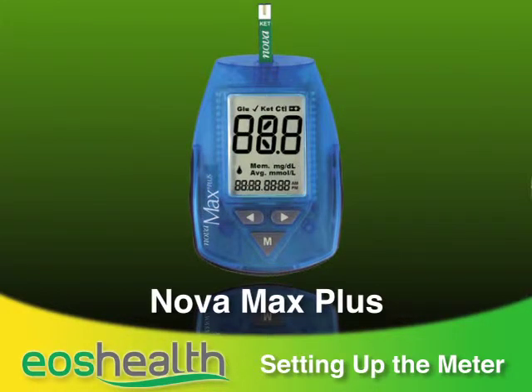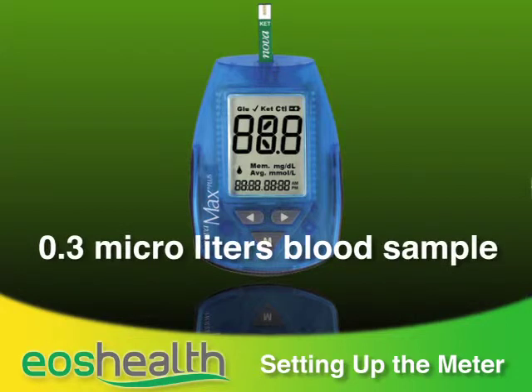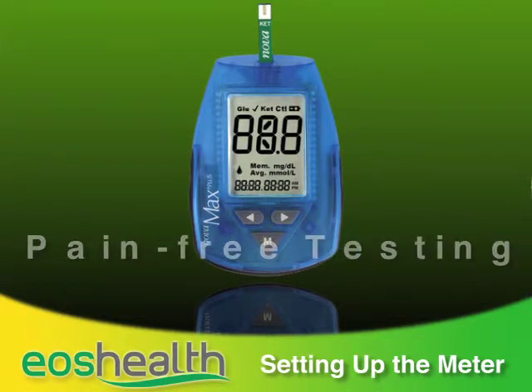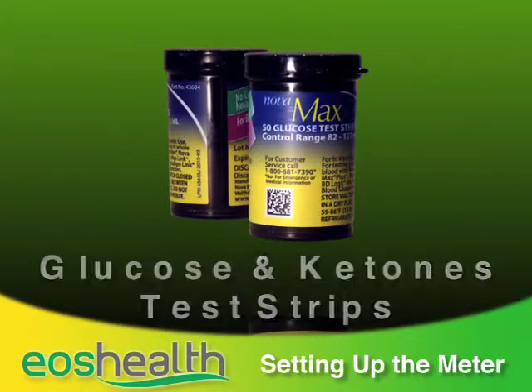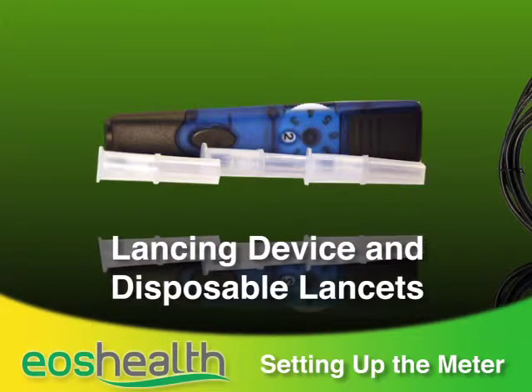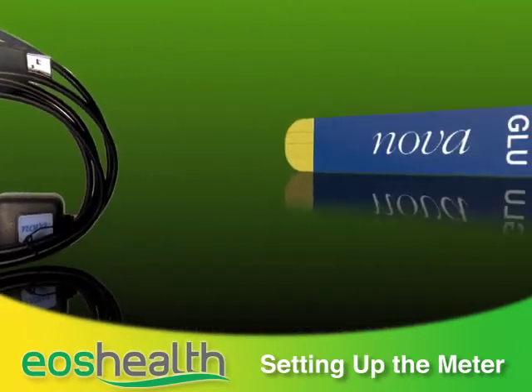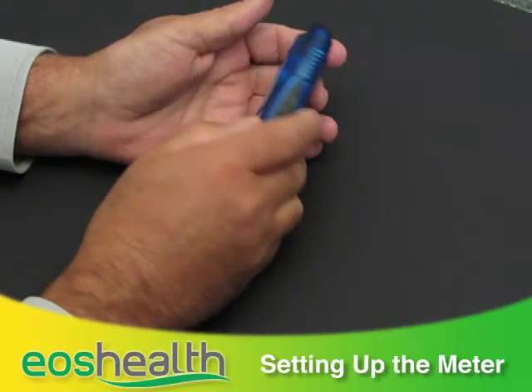We'll be using the Nova Max Plus blood glucose and ketones monitoring system — we'll call it Max for short. Max measures either your blood glucose or ketone levels, and it requires only a tiny blood sample of 0.3 microliters, so the meter can use a very thin lancet, making testing virtually pain-free. You receive the meter, packages of glucose and ketone test strips, vials of glucose and ketone control solutions, the lancing device, disposable lancets, and a cable for connecting to your PC. Be sure to only use the supplied test strips with the Max meter. Your meter comes complete with a battery good for about a thousand uses.